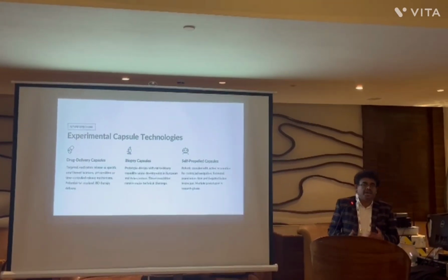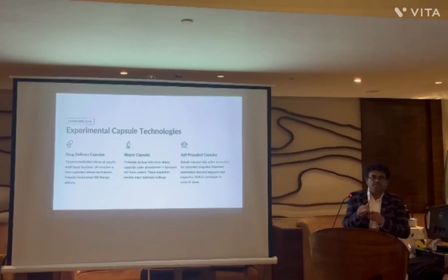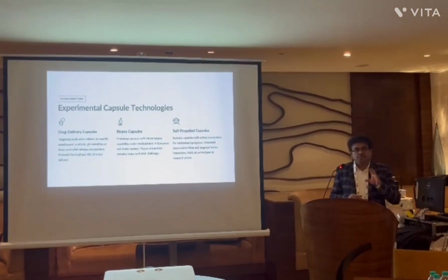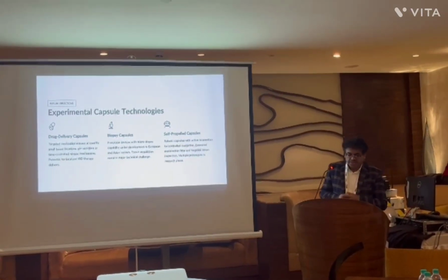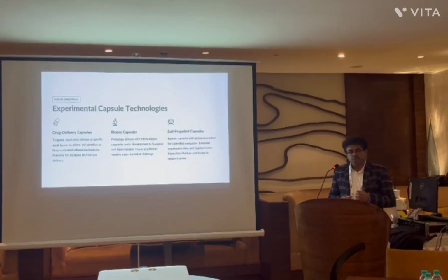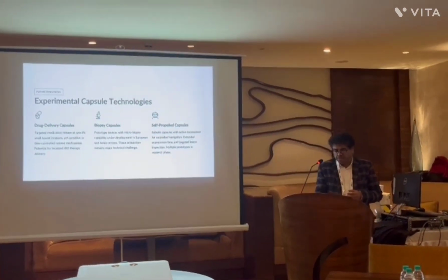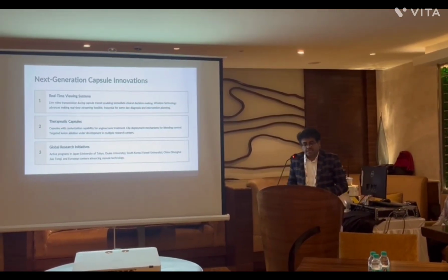Nowadays newer capsule technology is being tried, with innovations like drug delivery. For example, in IBD, we can deliver the drug directly to the site; pH-sensitive, time-controlled release capsules are being tried. And biopsy: if you identify a lesion or ectasia and want to take a biopsy, various centers are attempting microbiopsy capability, and we can go for biopsy capsules. Self-propelled capsules offer extended examination time and targeted lesion inspection, mainly for research purposes. What are the newer next-generation capsule innovations?